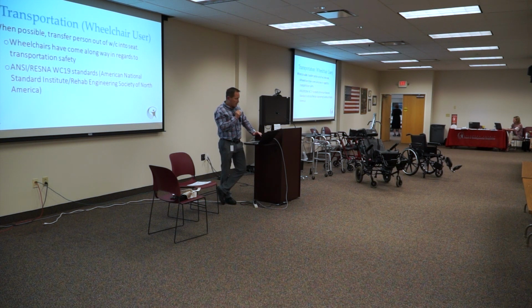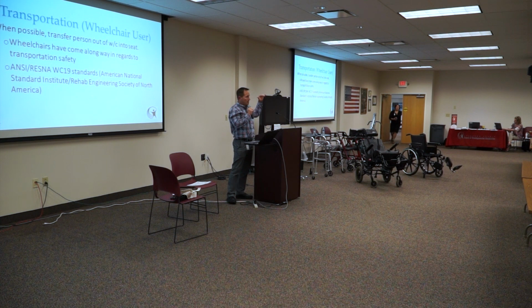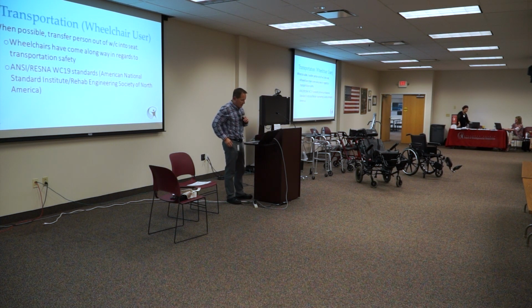Years and years ago, it wasn't that case, but we still would like to transfer a person out of a wheelchair into a regular seat if you can do it. So if they're having problems on the steps, we'll use a wheelchair to load them up in the van, but then if we can, we'll transfer them to a regular bus seat. It's a lot safer that way. There are standards now.